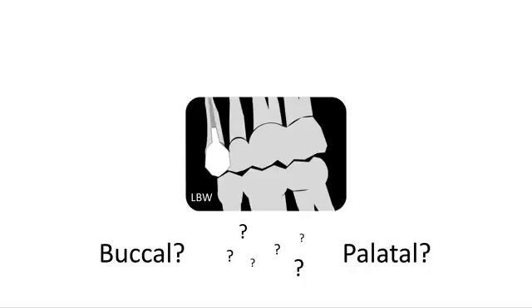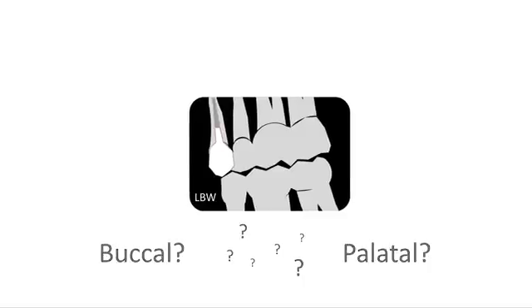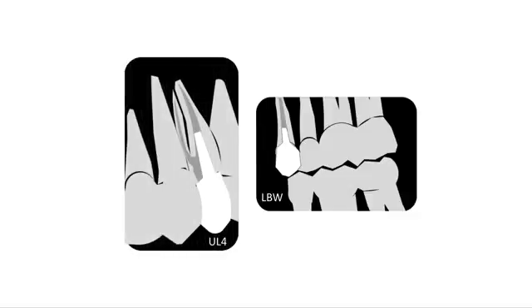In order to visualize the roots clearly, two radiographs are taken at oblique angles. So the vertical position is fixed and the tube is moved horizontally to create image number 2. The horizontal tube shift will cause the overlapped roots to move apart on the film, as you can see in the periapical image. SLOB stands for Same Lingual, Opposite Buccal.